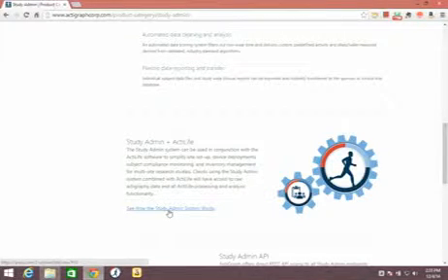We're not just producing this thing with us in mind, we're producing it with our researchers in mind. And we know that there's a lot of logistical challenges and it's expensive to do a study and funds are tight. And so we have developed this system to help you out. Take a minute to watch that presentation and I think it'll be helpful for you.